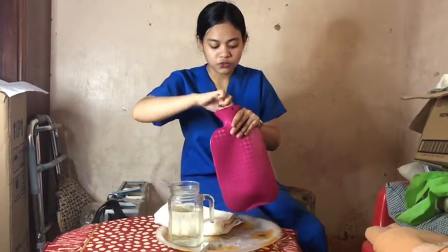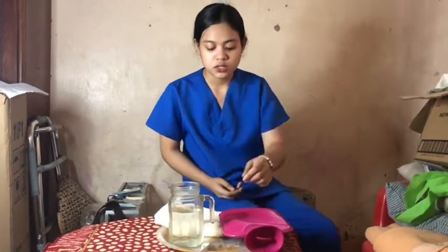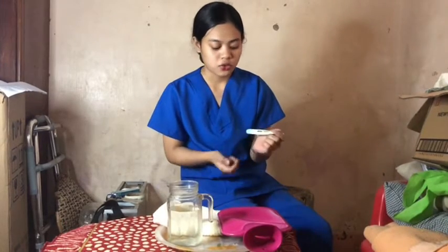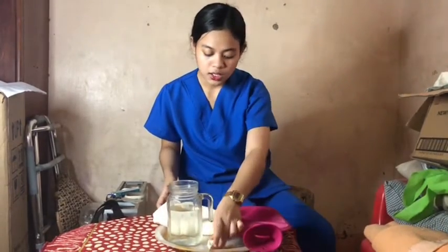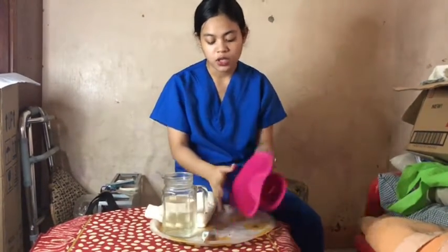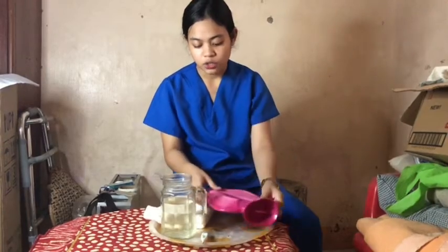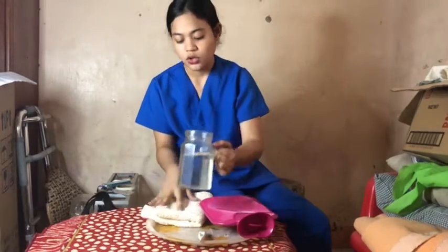So after checking the hot water bag, we need to gather all the equipment. The things that we are going to use are the bath thermometer, which is used to measure the temperature of the water. So this is the bath thermometer. Then next, we need a towel or a cloth cover. Then of course we have this hot water bag, and since we have this hot water bag, we have this hot water. Then next, after gathering all the equipment, we need to place these at the patient's bedside.